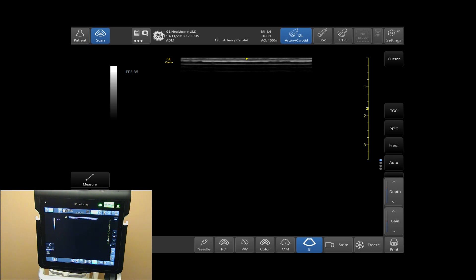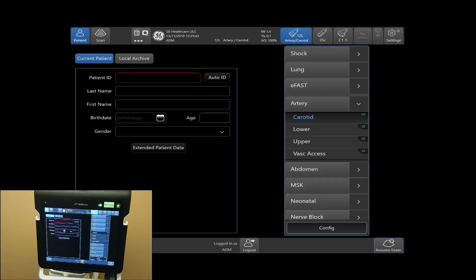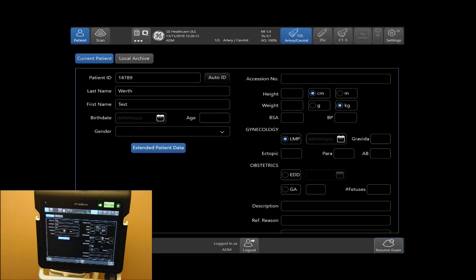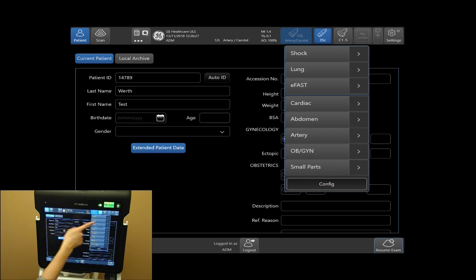To begin a patient, select your patient icon in the top left-hand side of your touch screen. To enter patient demographics, tap on patient ID. To go to your next field, simply select last name. To enter extended patient data, tap on extended patient data under gender and input your extended patient data. To select a probe, use the top right-hand side of your screen. And select your preset, which are listed right underneath. In this case, we will do an eFAST exam.